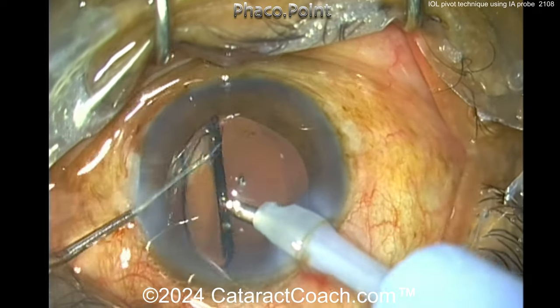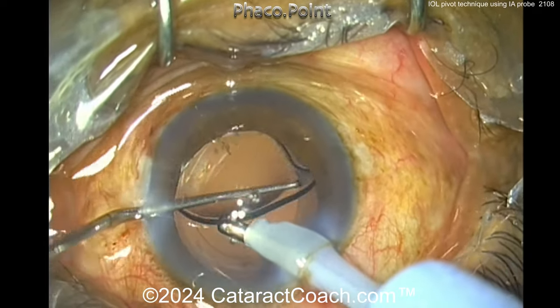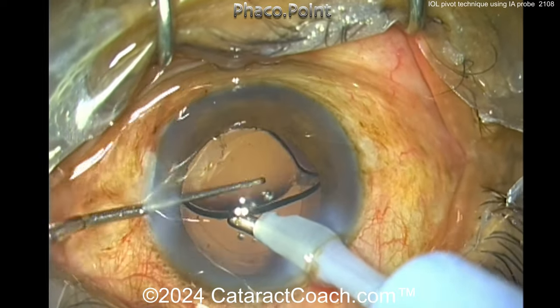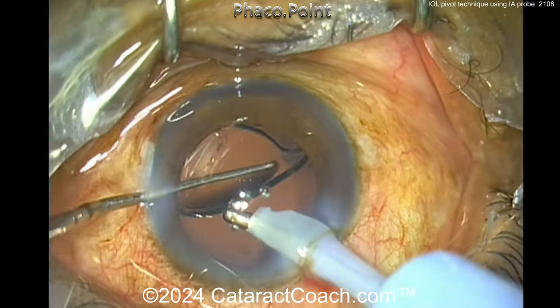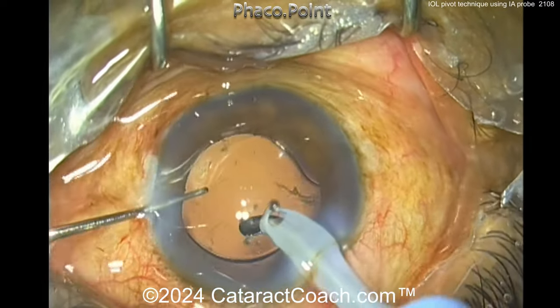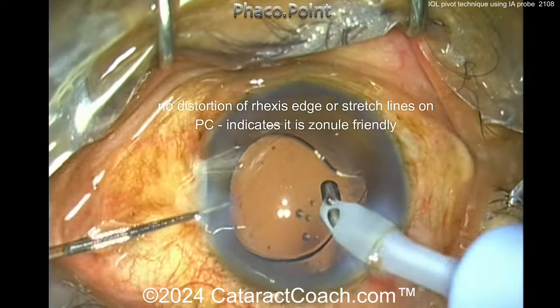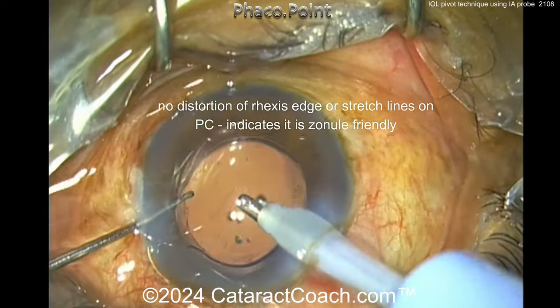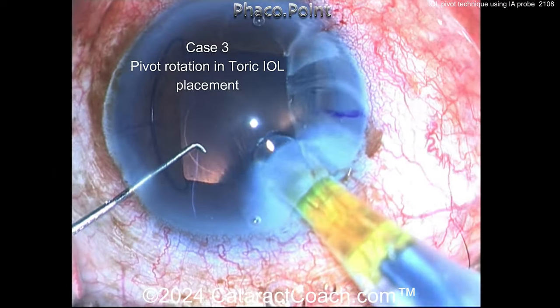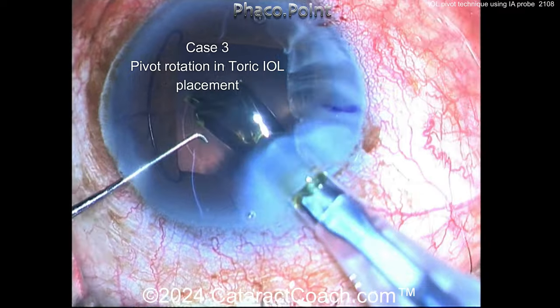Is this something novel? You have to be careful not to flip the lens over — with so much infusion and a big open bag, you can certainly rotate the lens in any direction. This proves especially useful if you have a toric IOL placed in the bag that is misrotated and you want to reposition it. You can go in both directions, whereas normally you can only go clockwise.